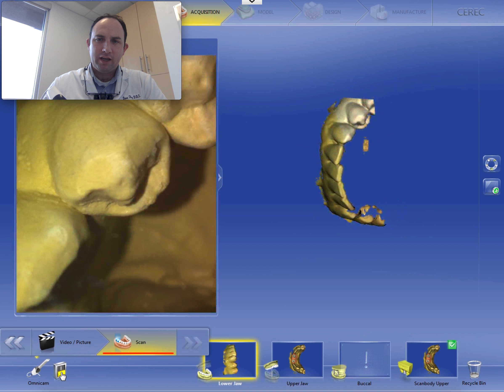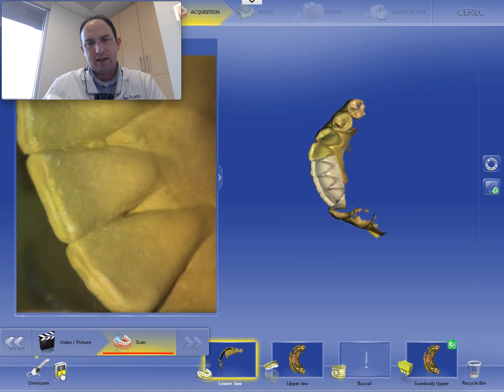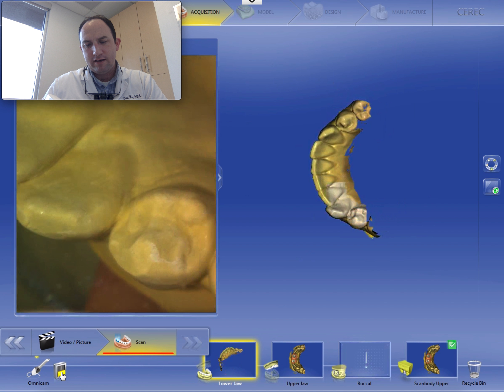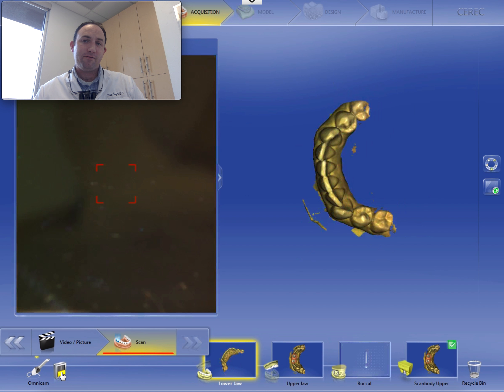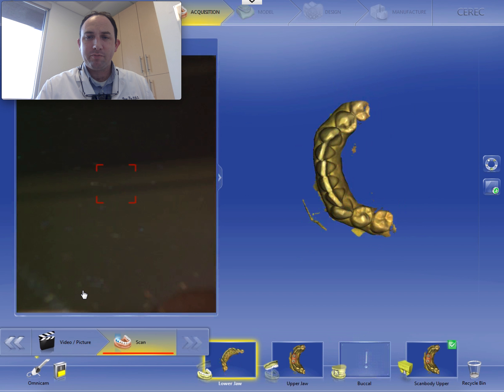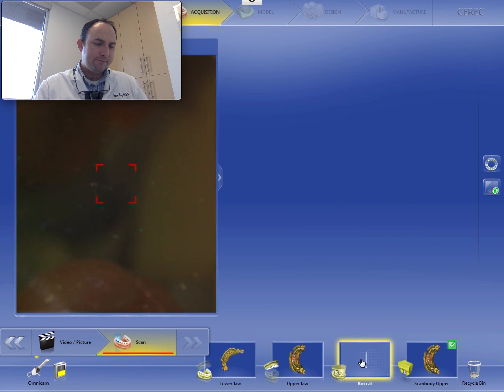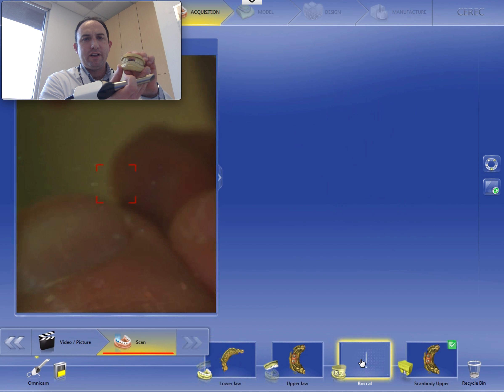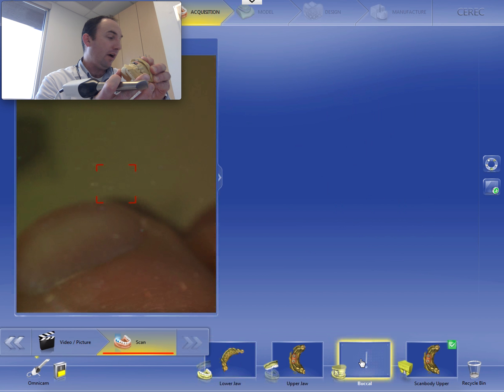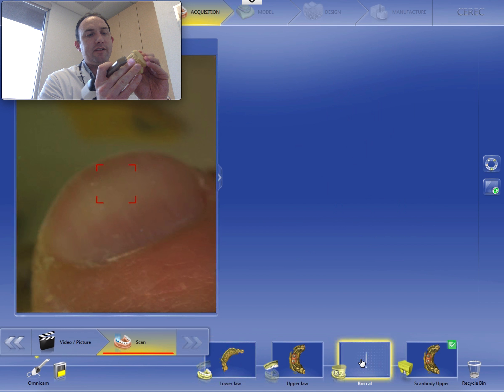And I think most of you will agree with me — when you scan a stone model, it tends to scan a lot easier than teeth, probably because it's dry and there's not as much saliva and all that stuff. So that's plenty. We got a little bit of extraneous imaging there. When we go down to the next image set, the buccal, I'm just going to hand-articulate these. They articulate really stably. I do have a blue mousse bite that we took, but these articulate in a very stable manner.